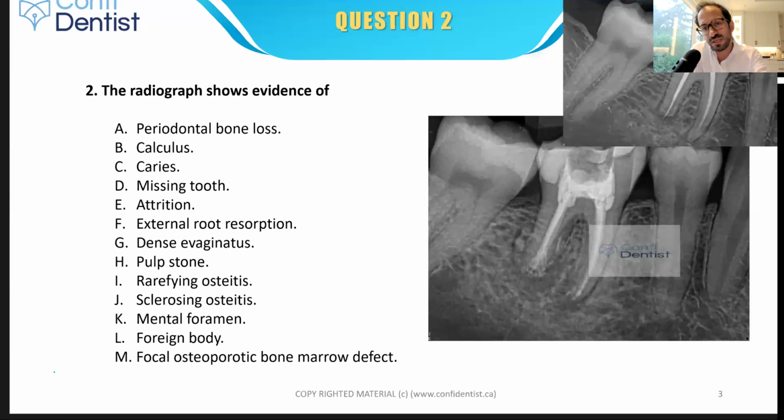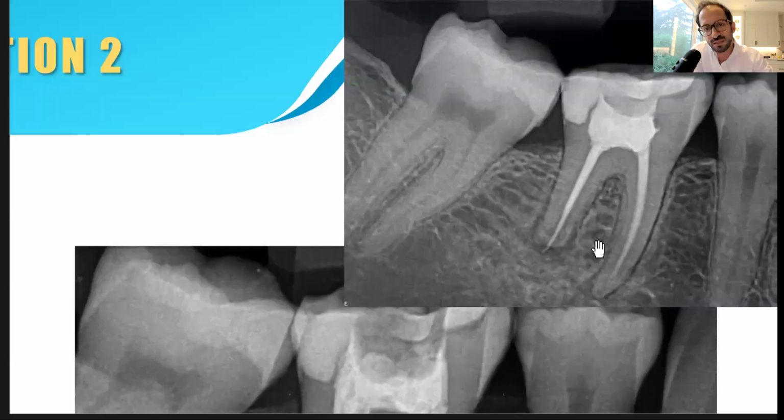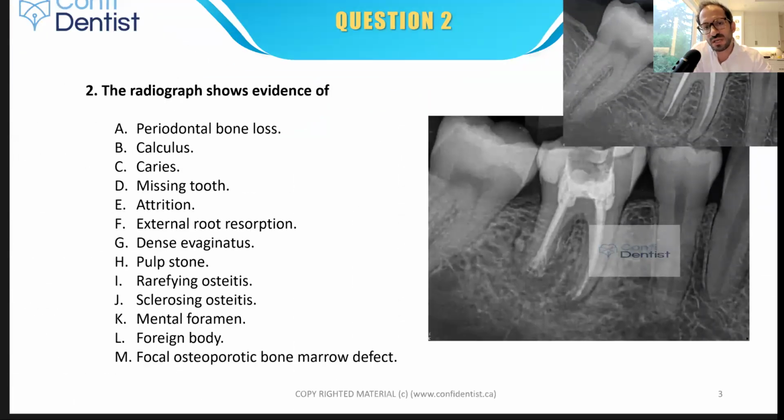So this was the initial case. The patient came to us with this situation and with pain, and retreatment was done for her. And this X-ray is immediately after the retreatment, okay? So actually, this is the X-ray the patient had usually around 1 year before this. At the time that we did the root canal for her, the apical lesion was more like this. But pay attention to the border of the lesion, which is ill-defined. So that helps to differentiate it from apical scar, okay?